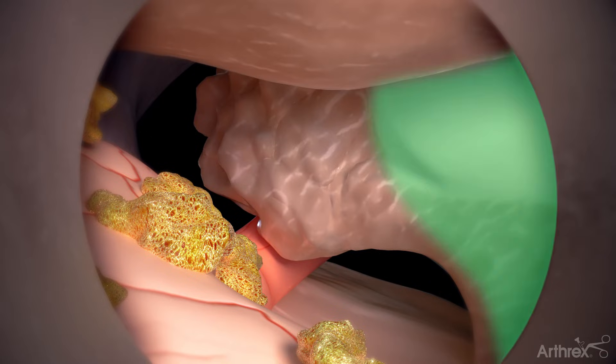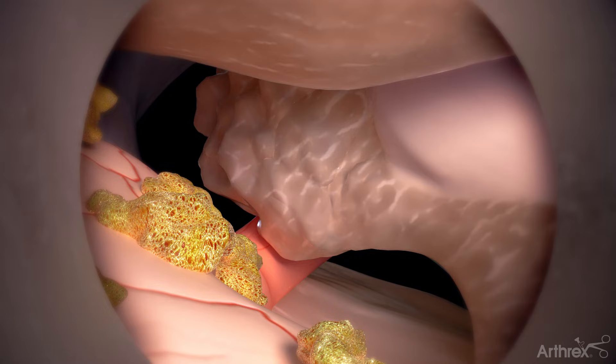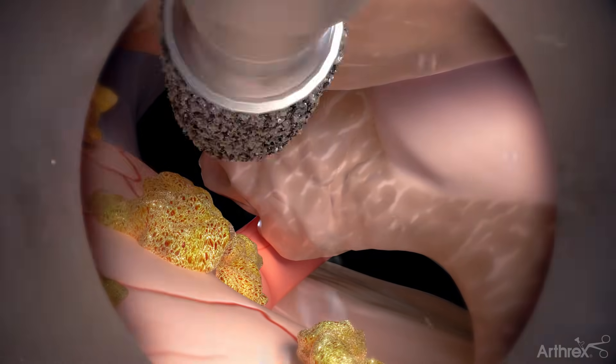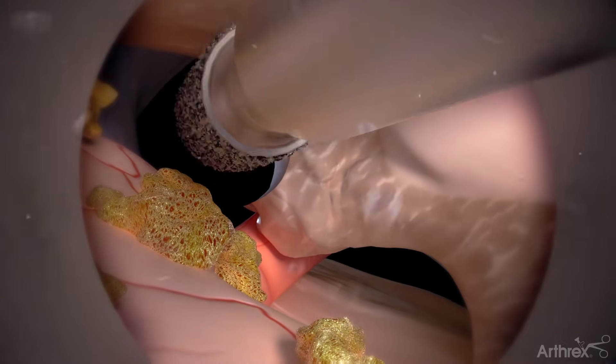Display the superior and inferior articular process of the facet joint. Next, use a burr, Kerrison rongeurs, and grasping forceps to remove the compressing tissue.